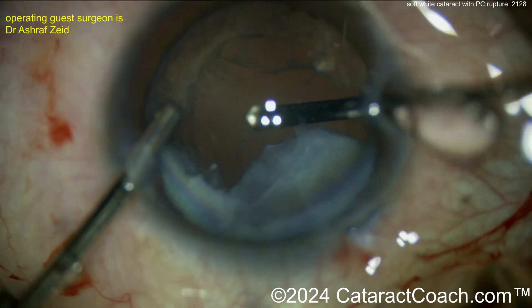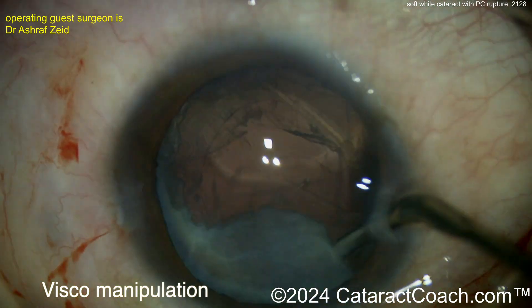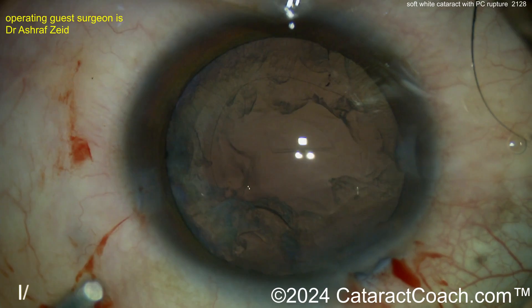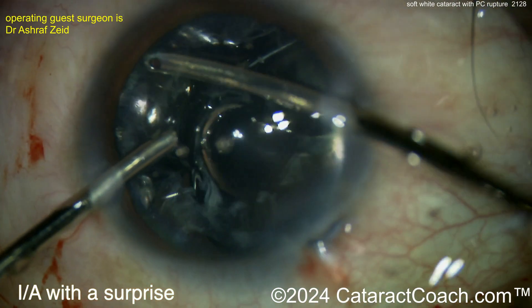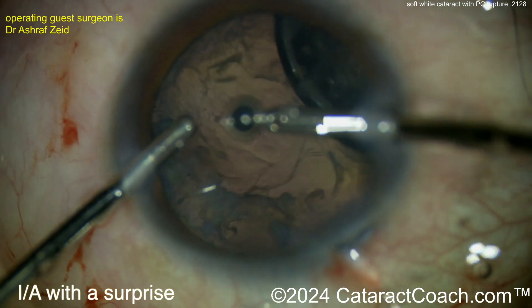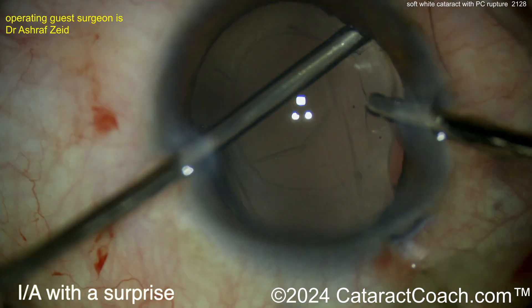There's still a sizable amount of lens material that needs to come out. A little visco-dissection to free up that lens material, then bring it up and out of the eye. Now it's cleaned up. Time for IA — watch out for a big air bubble in the IA infusion line; run the infusion outside the eye temporarily for a few seconds to make sure there are no air bubbles in your line.